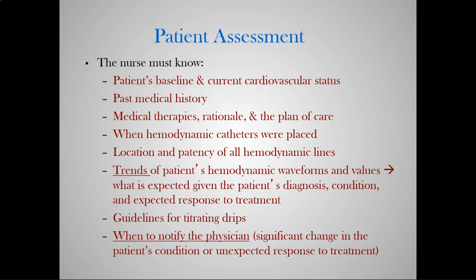And the trending tells us what the patient either needs, what they may have too much of, too little of, maybe their pressures are too high, they need to be managed medically with some medications. Okay, there's a lot of stuff we do, and that's where that trending comes into play. We're not just trending the numbers, we're trending the waveforms too. Okay, and then what we do is we compare these to our current diagnosis and to the current state of the patient, and we monitor and watch how they progress.